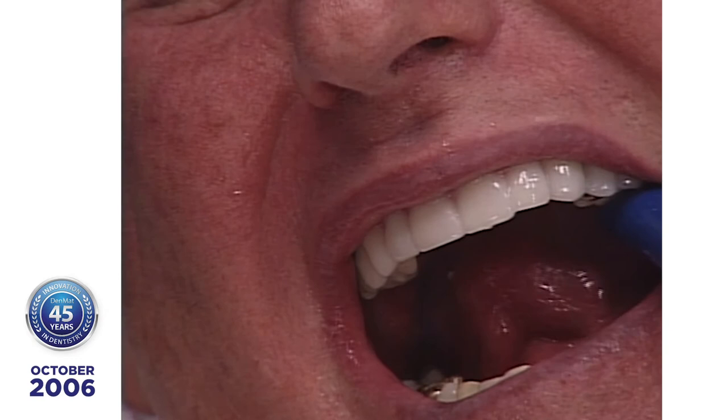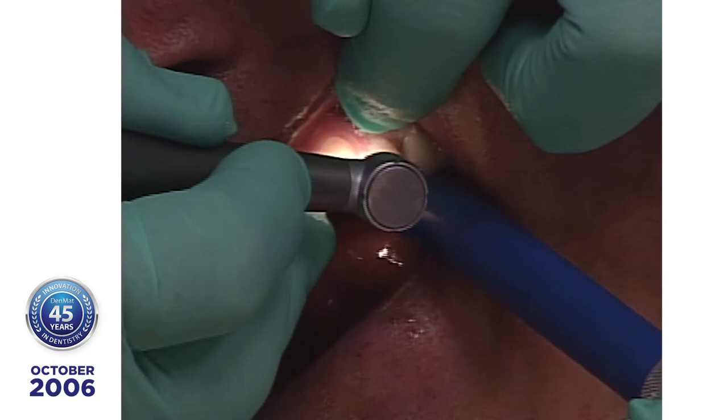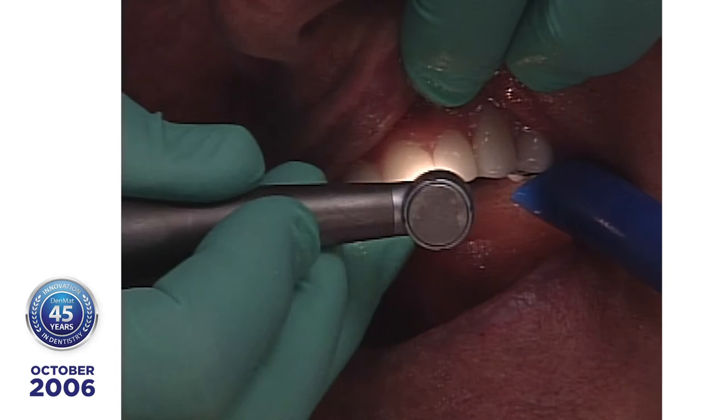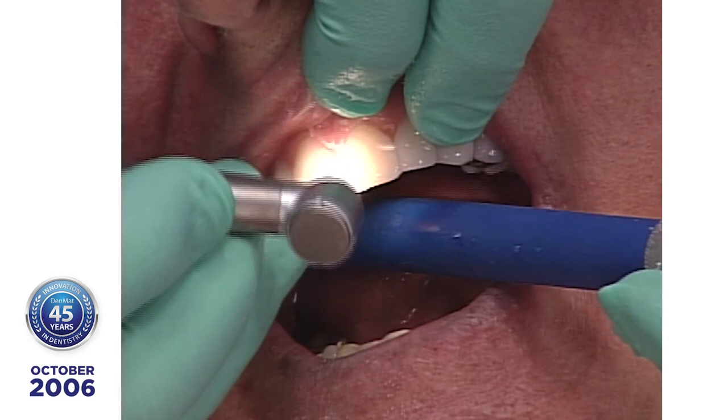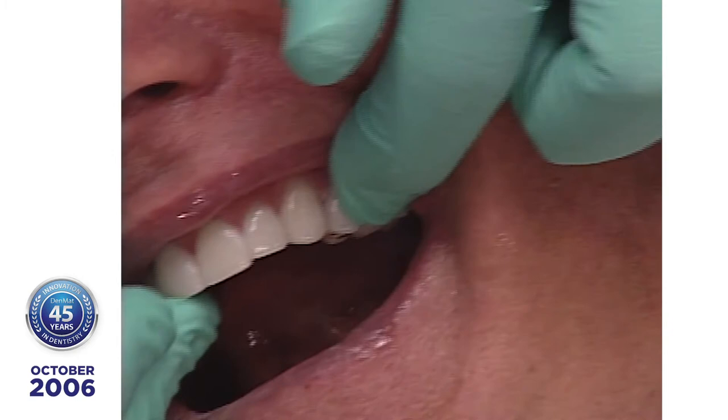Okay, so now we'll go to the inner proximals, and I'll start with the 12-fluted burr. By using a 12-fluted burr, I won't remove much of the porcelain, and I'll save that for when I'm using the porcelain finishing diamonds. Now, in just a second, I will show you how important finishing is. Because this is just like taking it off if it were still soft. And now let's take a look at his left side. And that is what it looks like after you remove the ultrabond.